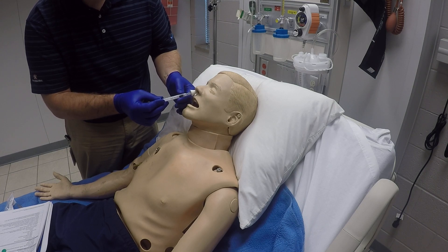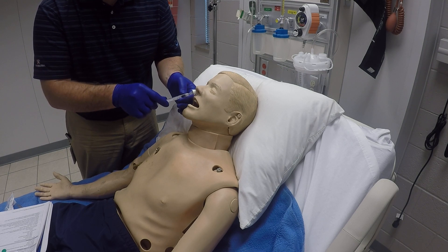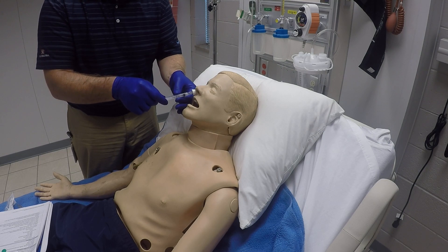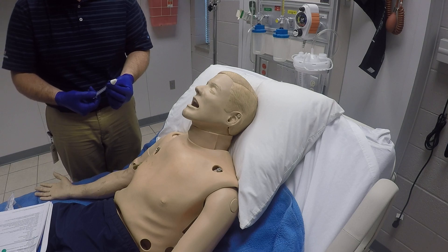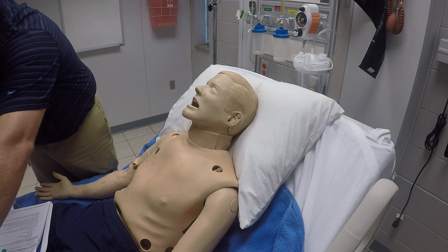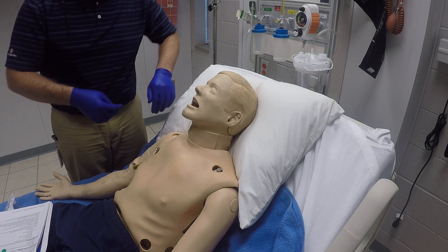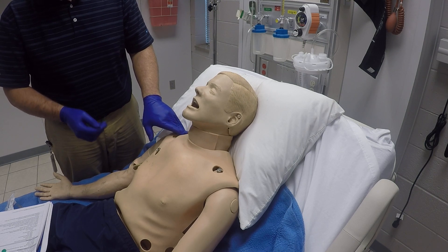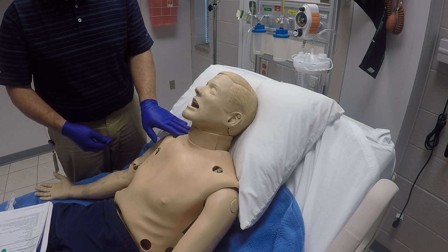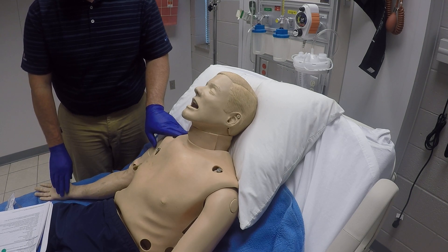We'll go ahead and insert it into the nostril — whichever one is larger and has fewer obstructions. We'll instruct the patient to inhale, and as they inhale we'll quickly push that in and atomize the medication up into the nostril. We'll remove and dispose of the device as needed. If we need to put an oxygen mask back on the patient or do anything else, we can, and then we'll observe the patient to make sure we're receiving the desired effects and there are no adverse effects.